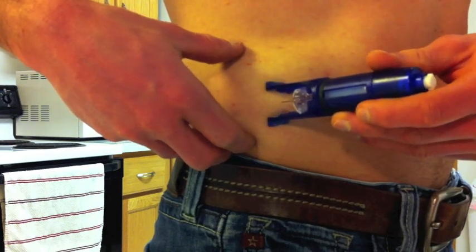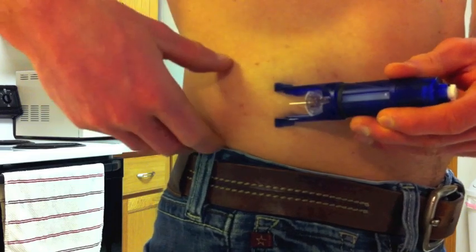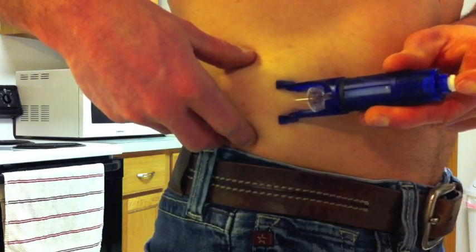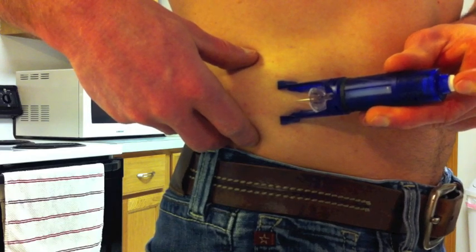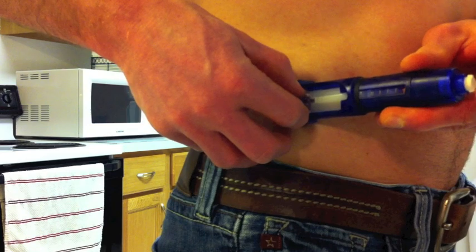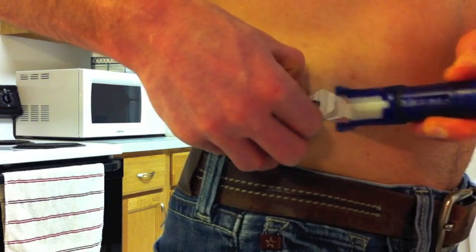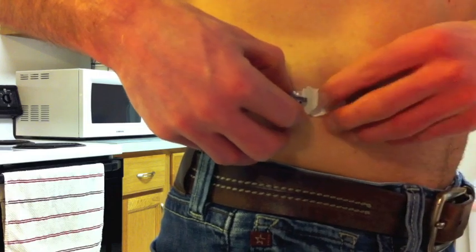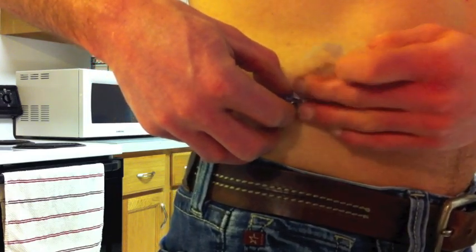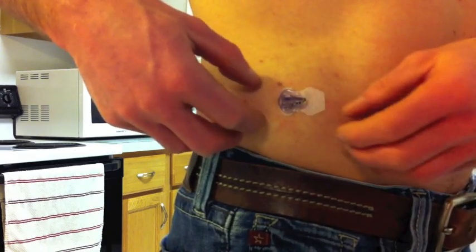You want to go at a 30 to 45 degree angle, and once you have it positioned you can release the lock, then make sure to slide it out along your skin so it doesn't pull anything. Then you can pull the tape protector and kind of pad that down.